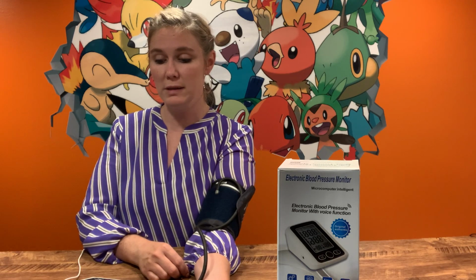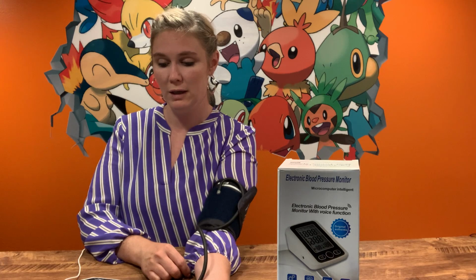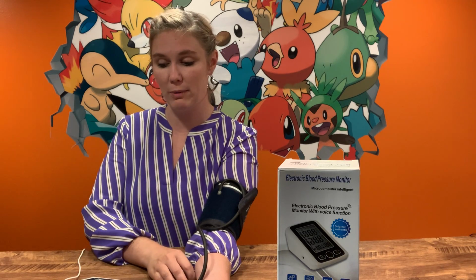So there's a nice gauge on this machine as well. So when you get your final reading, there's a green area, which is good, yellow, which you may want to keep an eye on things, and red, you definitely need to consult your doctor right away. I'll show you my reading once it finalizes.